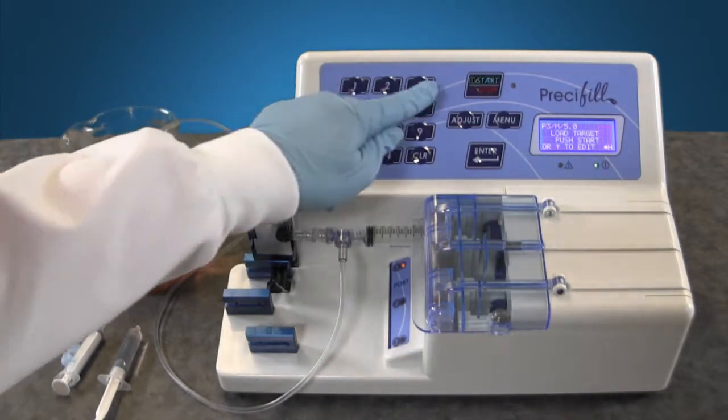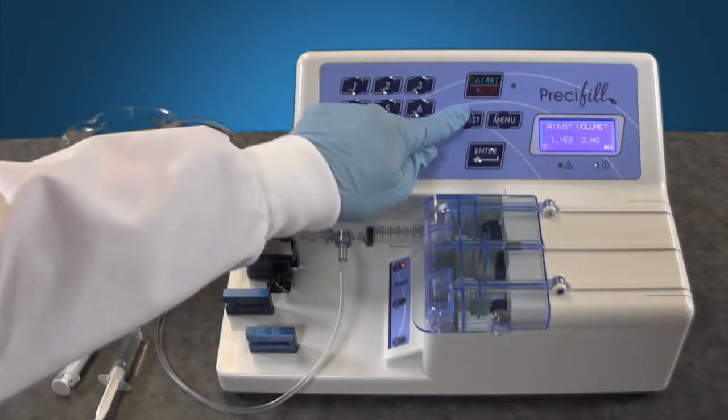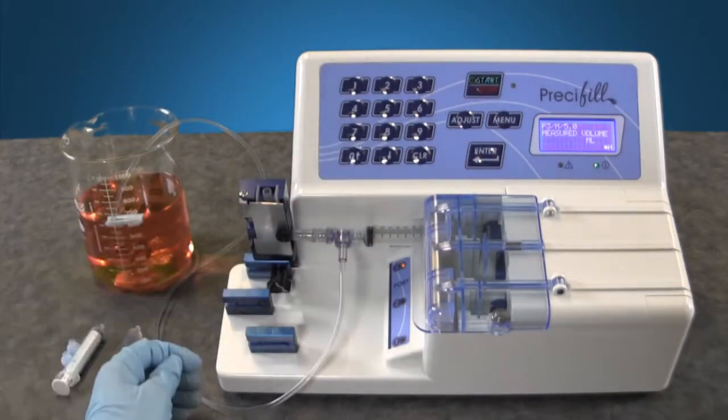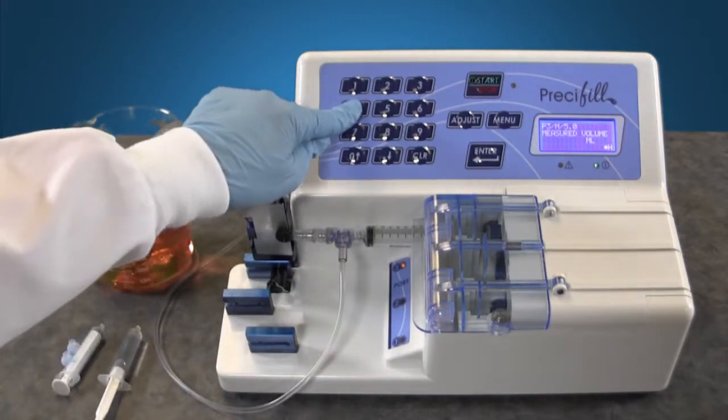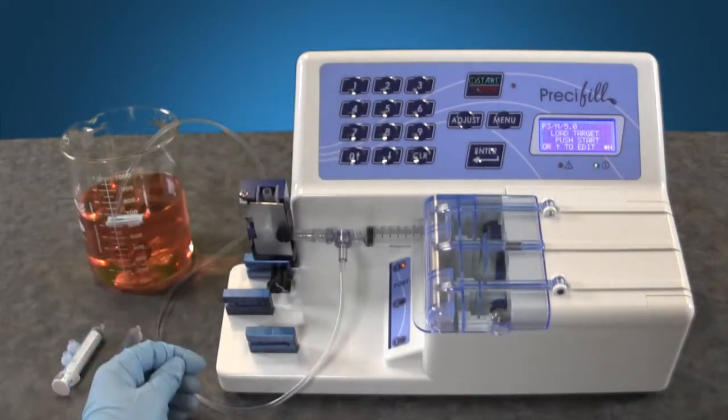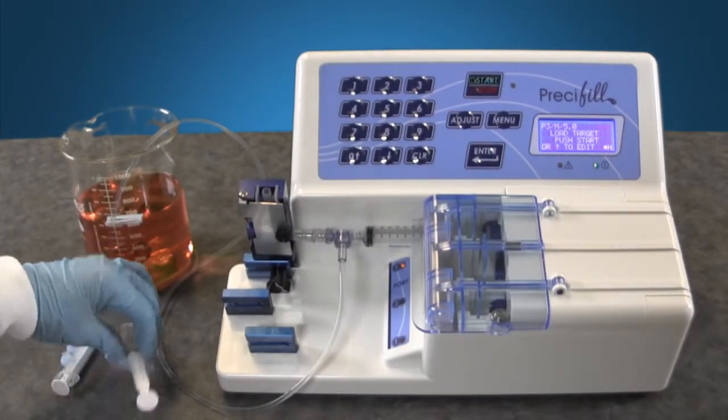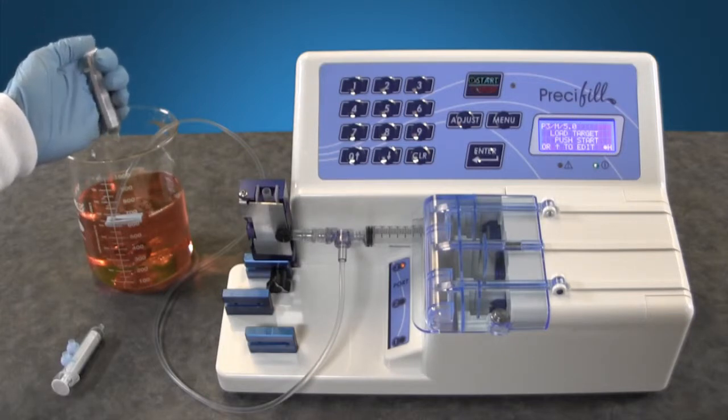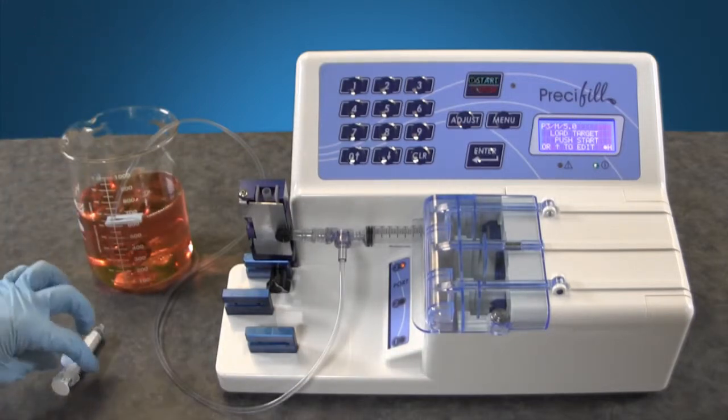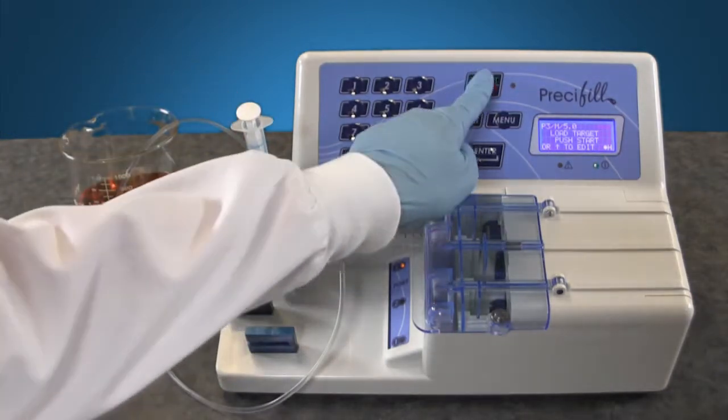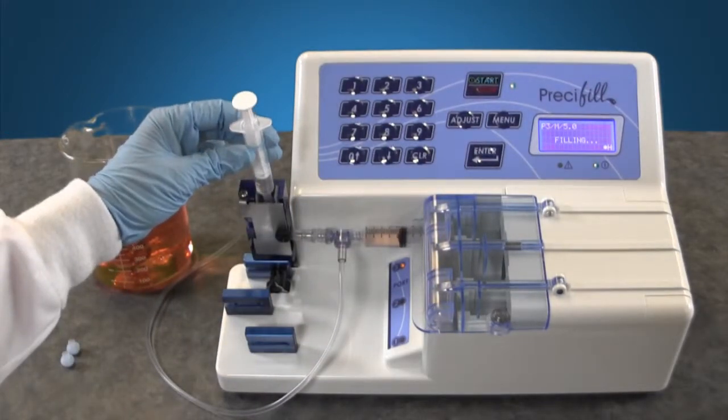Simply press the adjust button. Press 1 for yes and enter. Enter in the volume that the pump filled, in this case 4.6 mil, and press enter. Dispel the solution back into the beaker and use a new oral dispenser to fill. With the dispenser now filled accurately, you can complete your batch requirements.